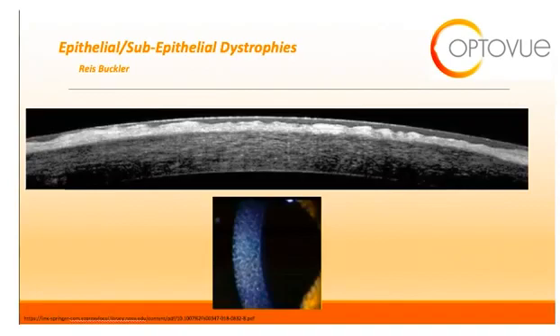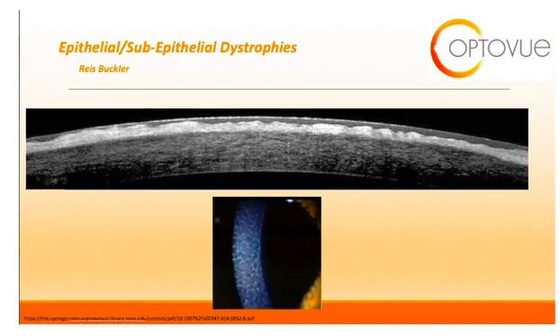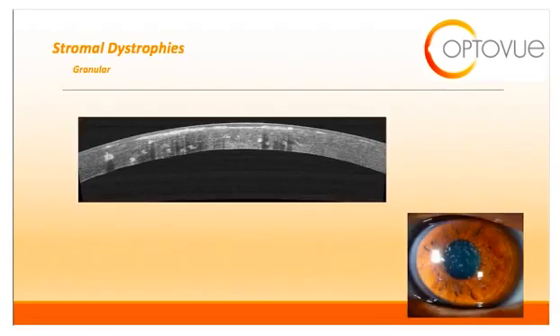The next dystrophy in this category is Reis-Bücklers. Clinically, Reis-Bücklers appears as subepithelial gray reticular opacities in the corneal subepithelial or epithelial space — it resembles the appearance of Chex cereal. On OCT, you can see a dense, hyper-reflective material at the level of Bowman's that can spread up to the epithelium.